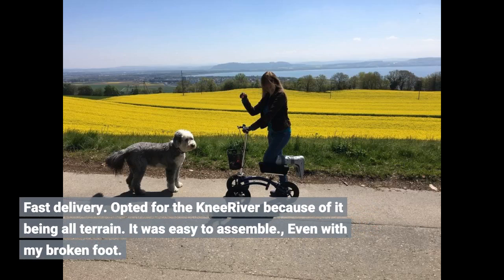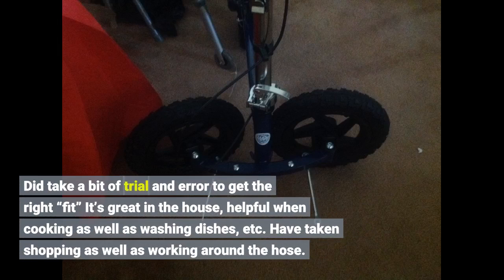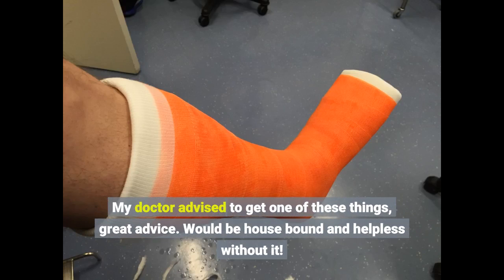Fast delivery. I opted for the KneeRover because of it being all-terrain. It was easy to assemble, even with my broken foot. It did take a bit of trial and error to get the right fit. It's great in the house, helpful when cooking as well as washing dishes. I've taken it shopping as well as working around the house. My doctor advised me to get one — great advice. I would be house-bound and helpless without it.